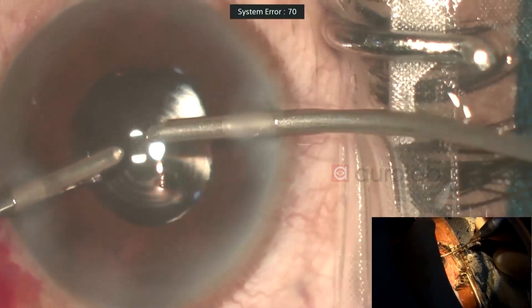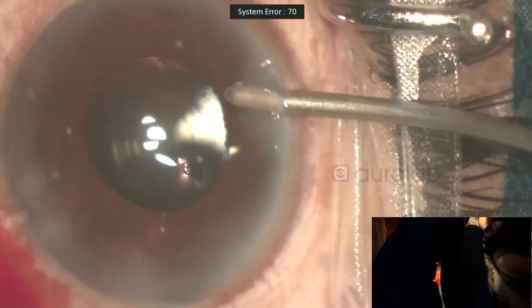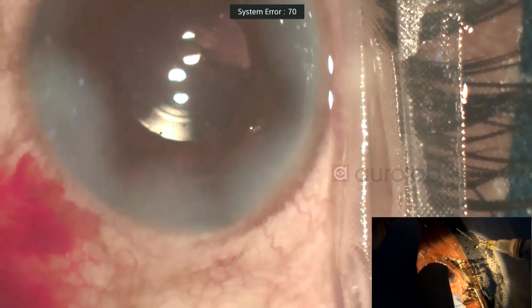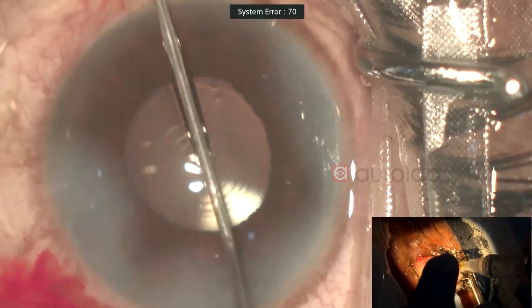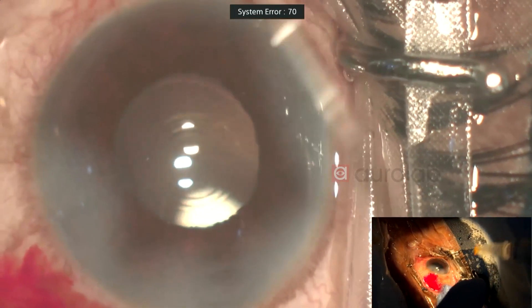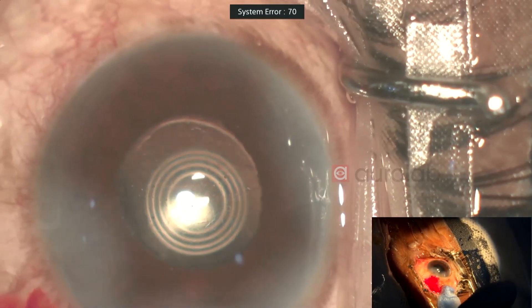Technic Synergy Toric 2. Wash has been achieved. Lens is centered well. We can see the rings and the glow — it's nice and tight. I'll just put a bit of Moxifloxacin in the AC. So that completes the surgery. I'm happy with the AC formed and the wound closure. I'll be stopping the relay of the surgery here. Thank you.